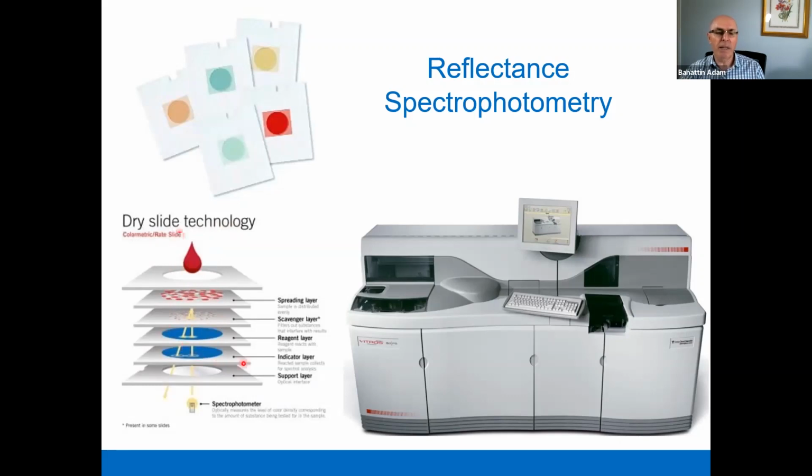The reagent needed for measuring the test is embedded in these slides. We send light from the source onto these slides, and some of it will reflect from the slides.